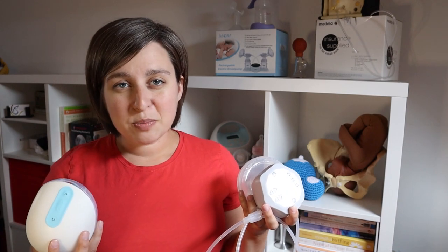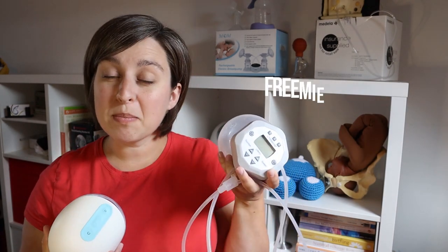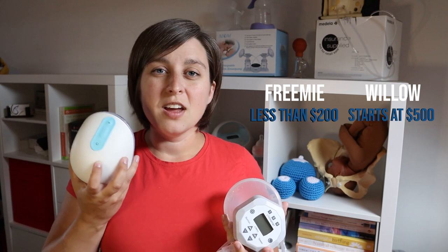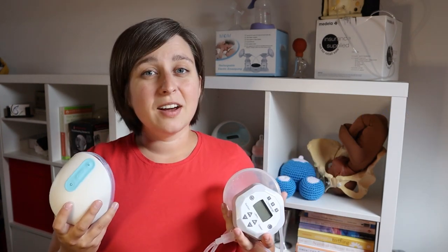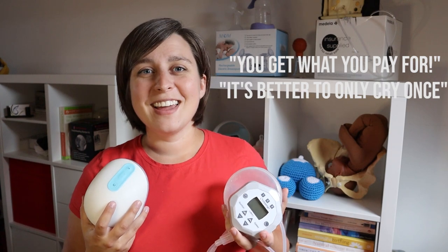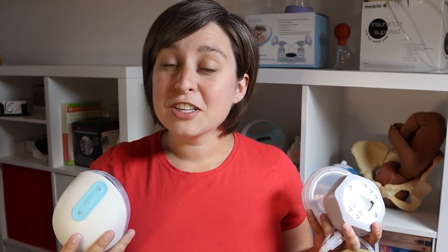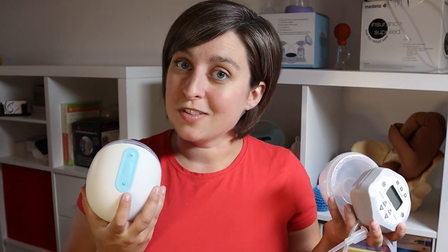The first obvious pro and con is the cost. The Free Me pump with the cups and the pump is less than $200. The Willow breast pump starts at about $500 and you might even need a couple of extra accessories with it, so that's a pretty big difference. If you're comfortable spending $500 on a Willow right out of the gate, that's an option, but if that is not doable for you at all, the Free Me has that going for it.